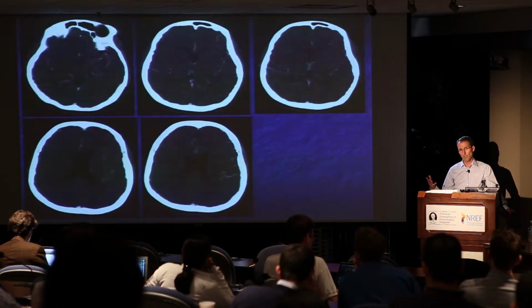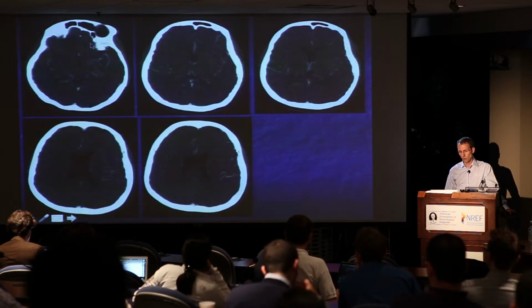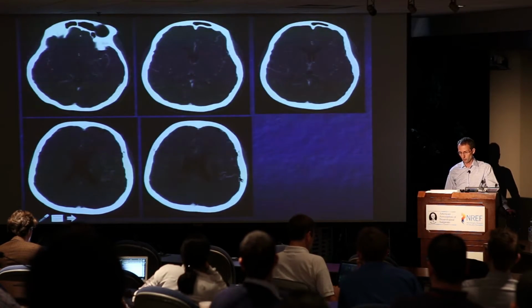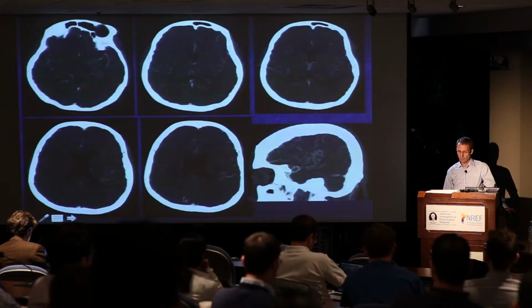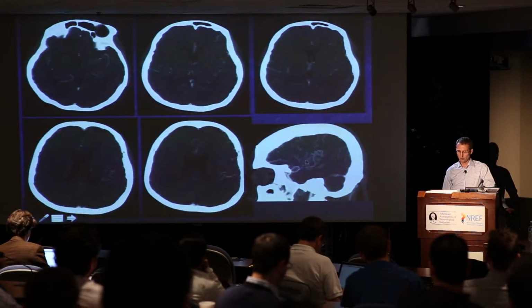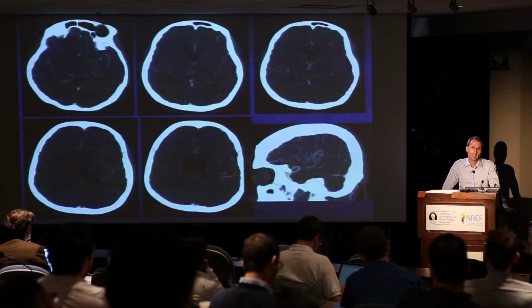And the CT angiogram, I don't know how well this projects, shows no obvious abnormal external branches and no obvious abnormal internal branches, and yet there's a bunch of corkscrewish, tortuous vessels everywhere you look. The more you look, you'll see all these bizarre, corkscrew-type vessels in and around the middle cerebral branches. This is a crappy 3D reformat, but again, there are just too many little notes in here with a bunch of tiny corkscrew vessels. Those should be red flags for arterialized small cortical veins. And if you don't see an obvious arteriovenous shunt, a dural fistula should be high on the list.